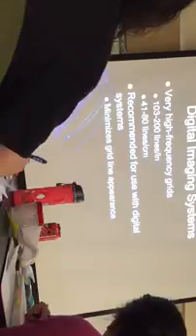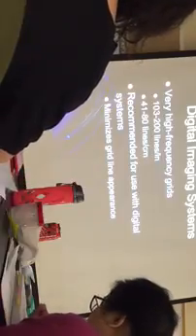When you process, especially with CR, a lot of times you will see a defect called the Moiré effect. We'll talk more about the Moiré effect later, but I just want to mention it to you. You end up with really weird patterns on your image, because when your laser is scanning, if the grid lines are not thin enough, it can grab two lines. I think Carlton talks about the Moiré effect. It's a real problem where you end up not with grid lines, but with these shades. Hard for me to describe it, but if this is your image, a lot of times you will see lines going like this on your image. That's the Moiré effect. Kind of like that.